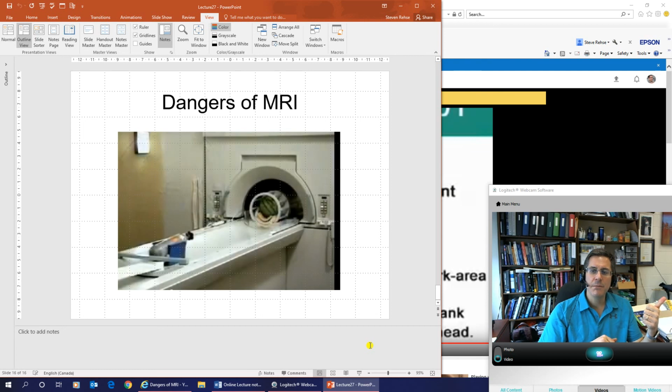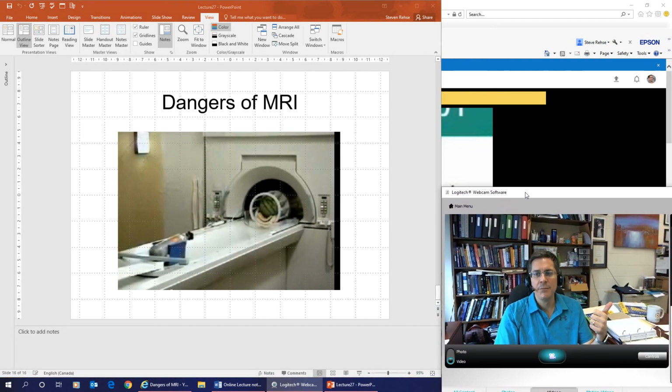Nuclear medicine, you have to put radionuclides into the patient. That's not so great. X-ray CT, beautiful detail, but ionizing radiation is bad. MR and ultrasound, essentially completely safe. No radiation, no radioactivity. The only problem is, like I said, currently a scan takes about 15 to 30 minutes in that range. That's the time it takes the technicians to get you in, get you laying on that bed, get you into the machine, get some pre-scans and get the data.